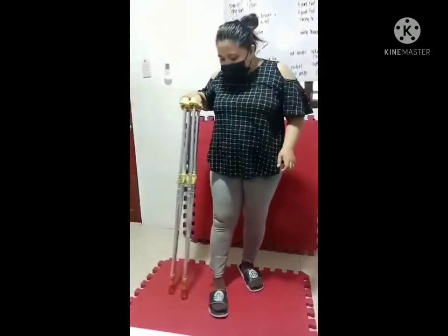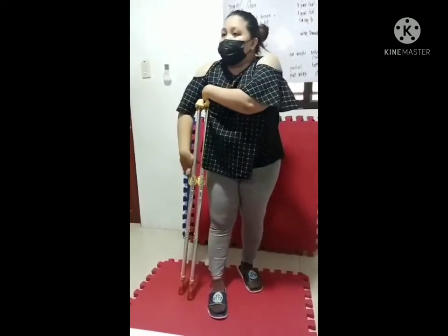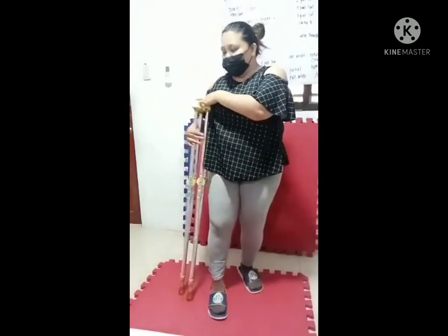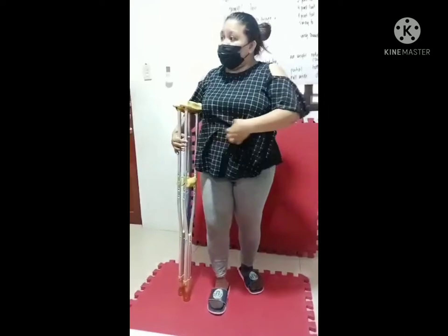The patient should be wearing shoes. Measure the axillary pad: three finger-breadths below the armpit to avoid nerve paralysis and nerve damage such as crutch palsy. We also need to apply a gait belt for support and to avoid falls.